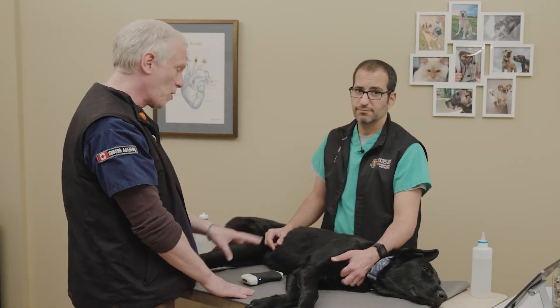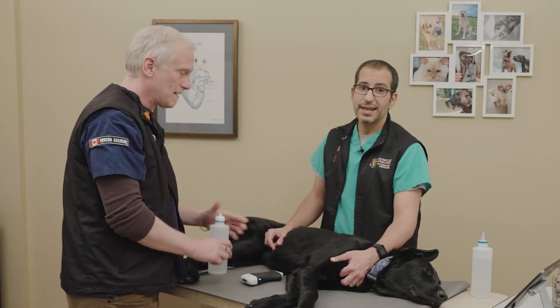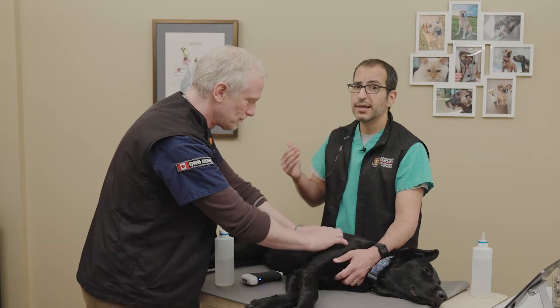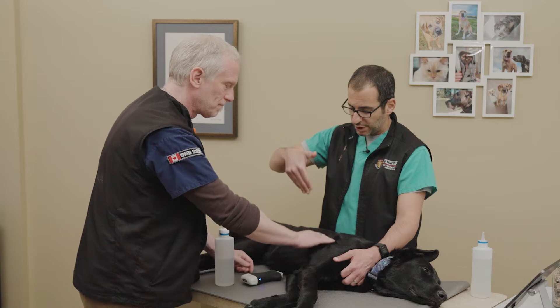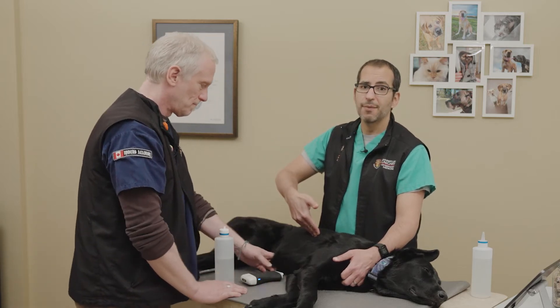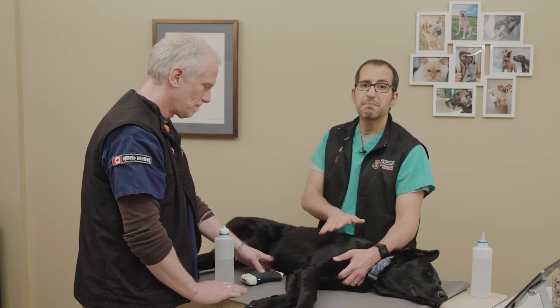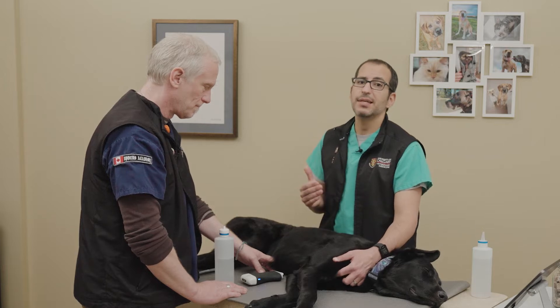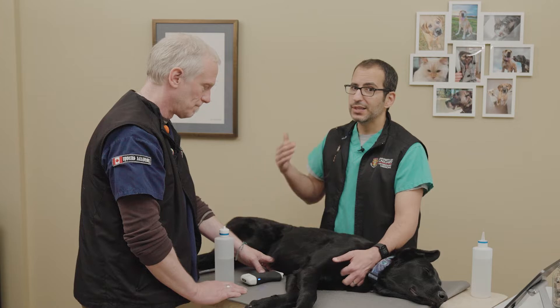Now let's put the probe on and show those borders and some tricks of ultrasound when scanning the chest. A key thing is that you have to make sure you start over lung. That sounds silly, but we've seen instances where you choose a random spot, thinking it's going to be thorax, and you're actually over the abdomen. So use those boundaries we just talked about. If you start your scanning behind that cranial border — the forelimb — you're guaranteed to be over lung.